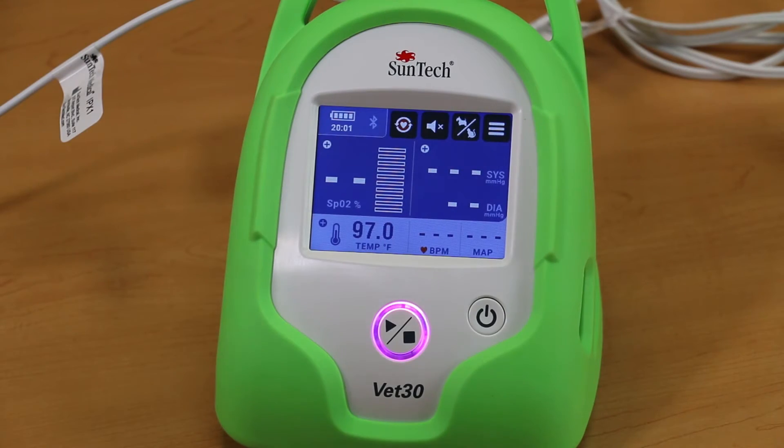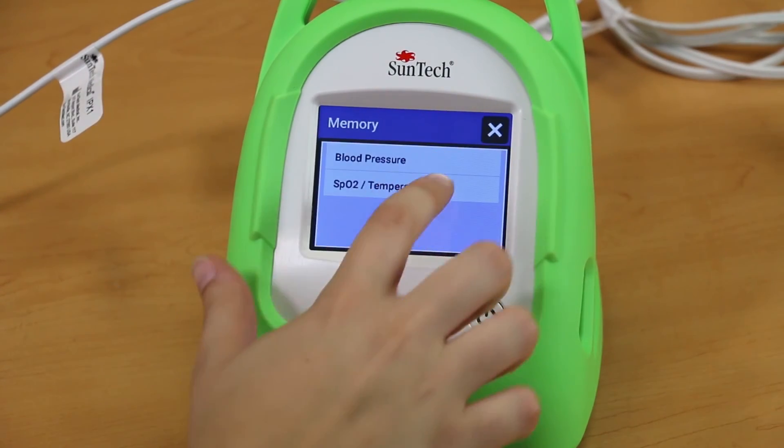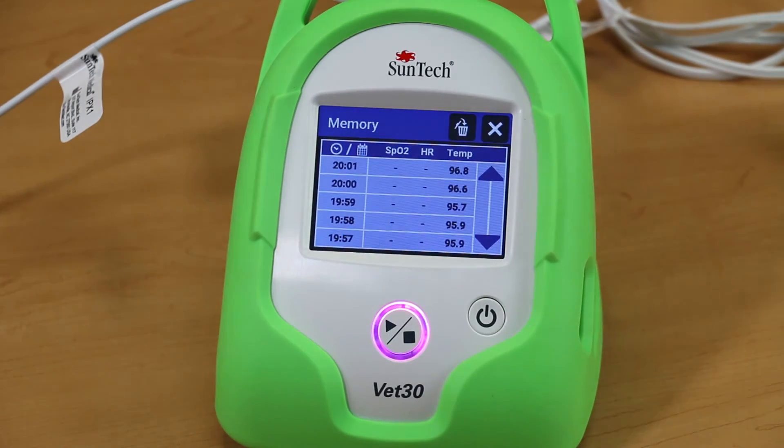Temperature measurement is continuous while a patient is connected, and a data point is saved to memory every 60 seconds. Up to 960 measurements can be saved in the memory.